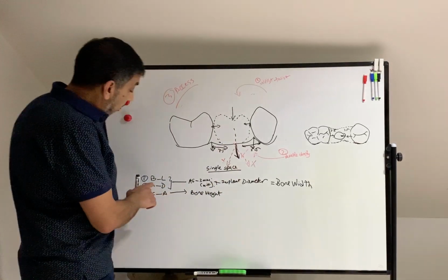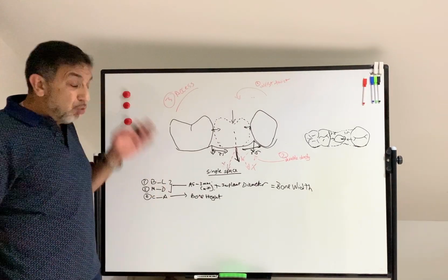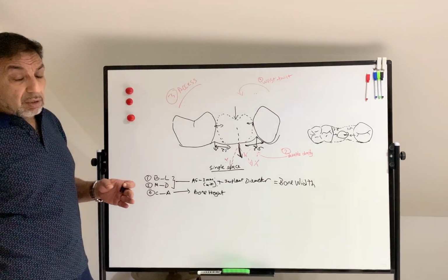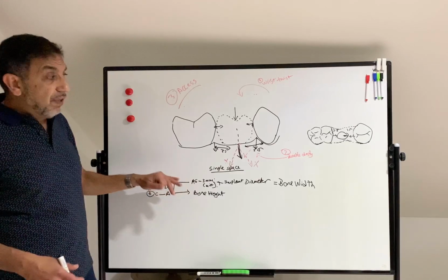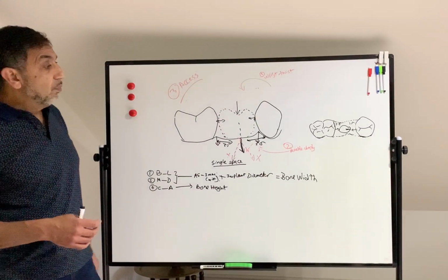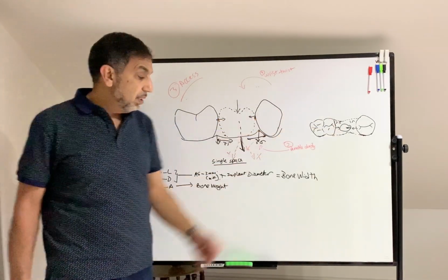Obviously, the buccolingual width has to be adequate. We have to, as a rule, have 1.5 to 2 millimeters, better 2 millimeters, of buccal and palatal bone covering the implant, okay. So you have to have this. So you've got to figure out how much width of bone you have from your CBCT or from your ridge mapping. I think ridge mapping is quite historical, so now it's measuring it from the CBCT.